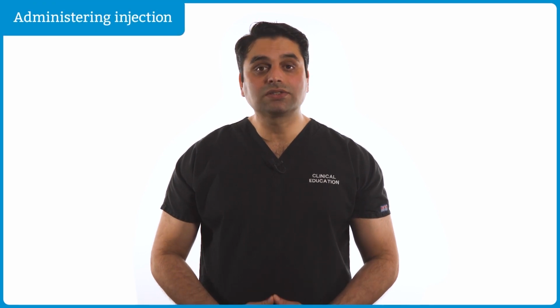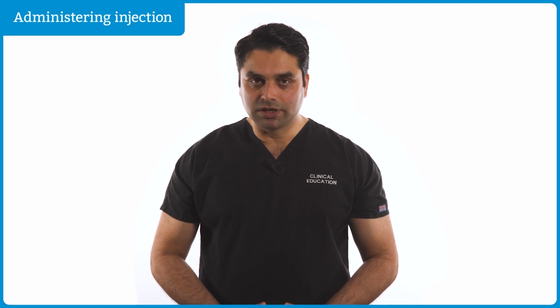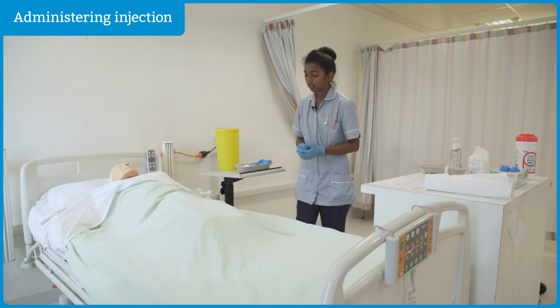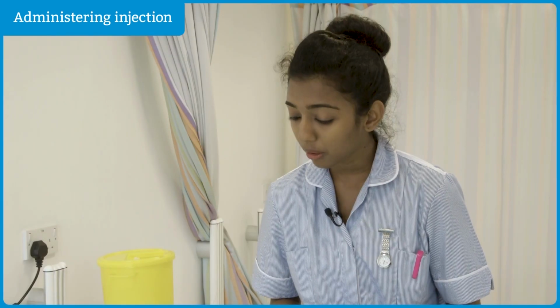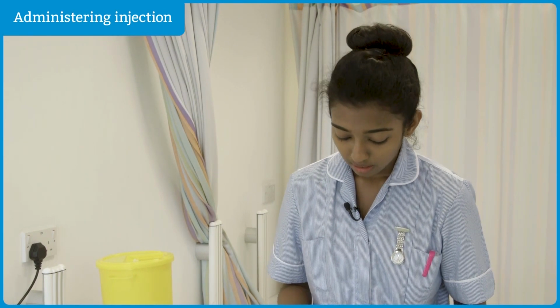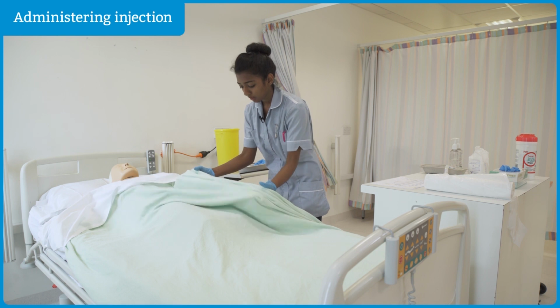Returning to the patient, ask if they are happy for you to expose the area of injection. If in a community setting, request permission to use their sink to wash your hands. Hello, Anne. Hi. Am I all right exposing your thigh to give the injection? Yeah, that'll be fine. All right. So I'll make sure that the patient is exposed to the minimum.